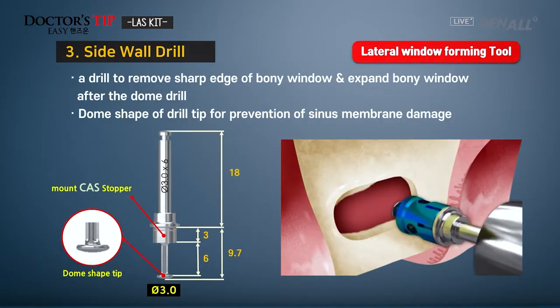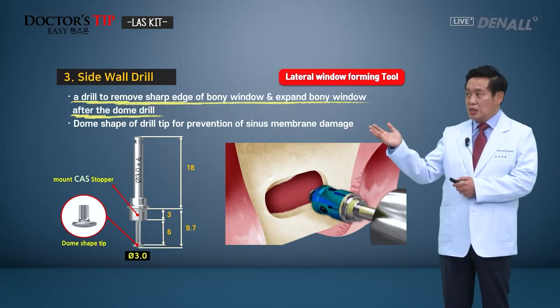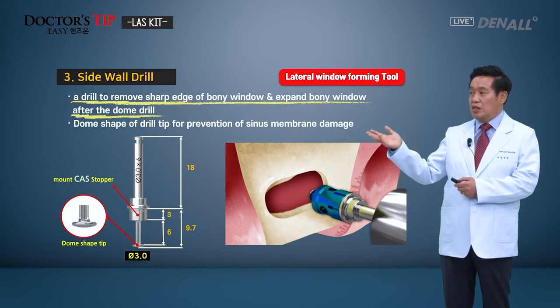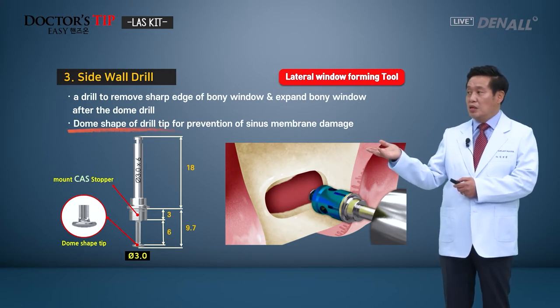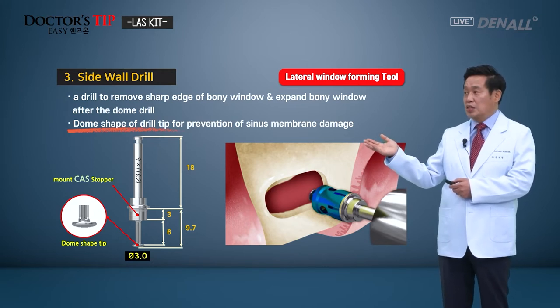Then you have the sidewall drill, which is used after the wide dome drill. If you have sharp bony edges, then this is the drill to remove the sharp edges of the bony window. So you can cut the side wall, so it has the drill for that and a tip to safely protect the sinus membrane. It has a dome-shaped drill tip.